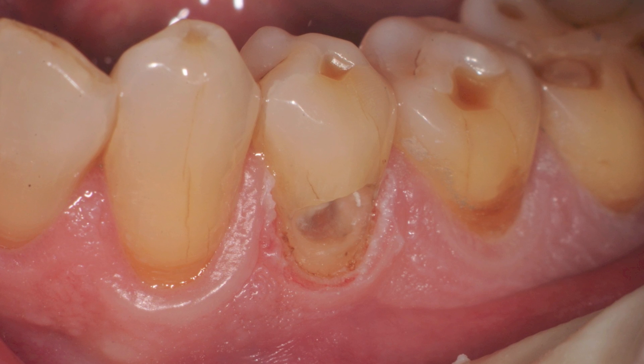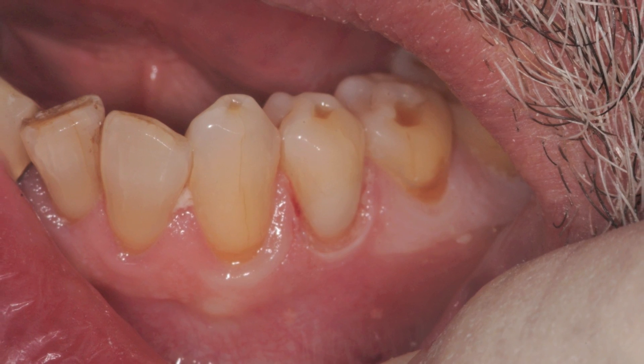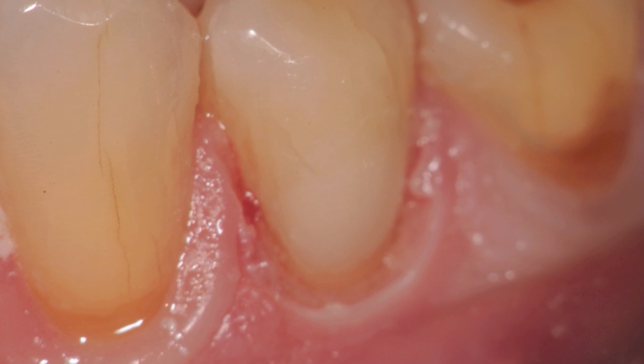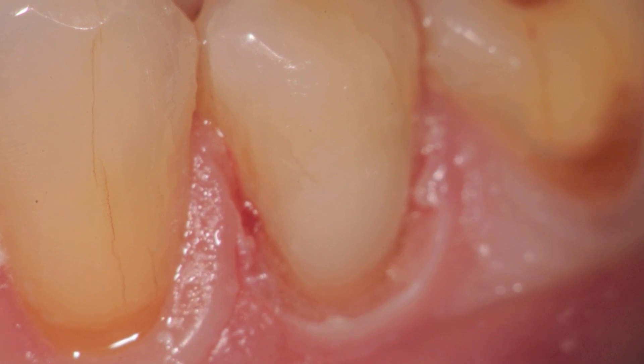Air abrasion is completed. The restoration is etched, bonded, and a composite restoration is placed — shown here at low magnification and here at the final restoration at high magnification. Again, notice the lack of charring and how the tissue will quickly reappear.